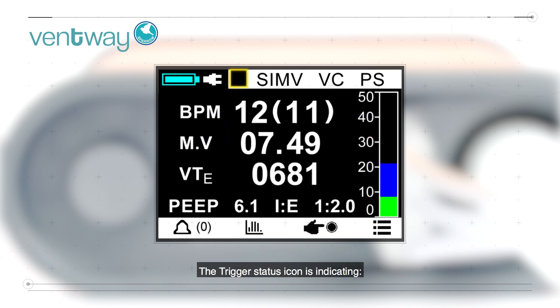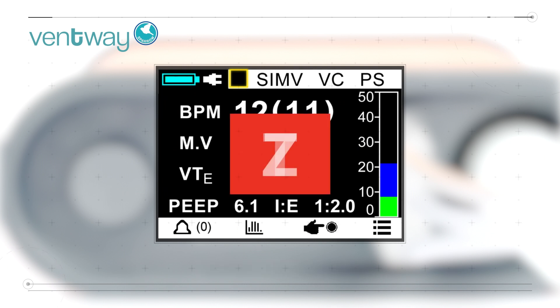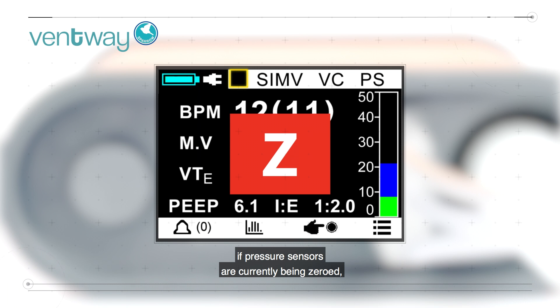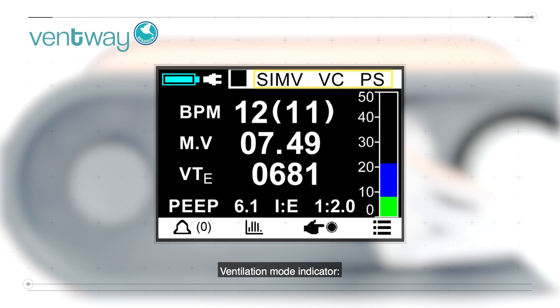The trigger status icon indicates if a patient trigger is detected, if pressure sensors are currently being zeroed, and if a cough was detected. Ventilation mode indicator.